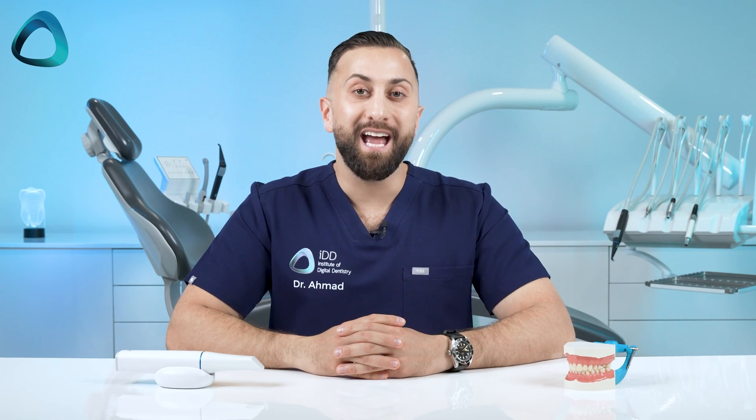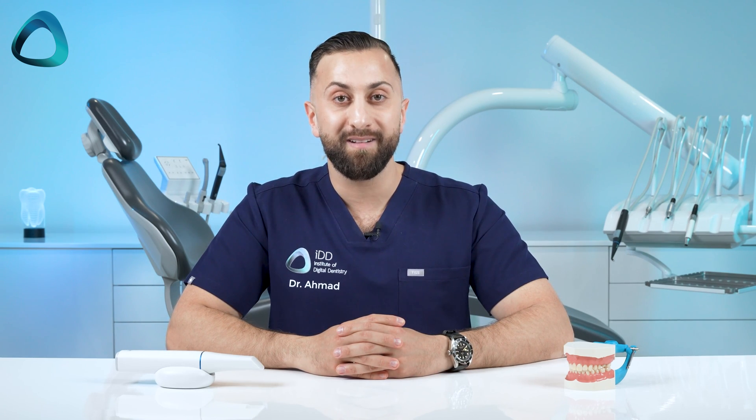And that covers some of the latest hardware features of the new Medit i900. An exciting day as we welcome this new Medit scanner to the world of digital dentistry.